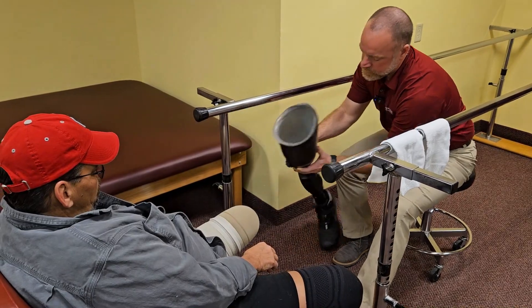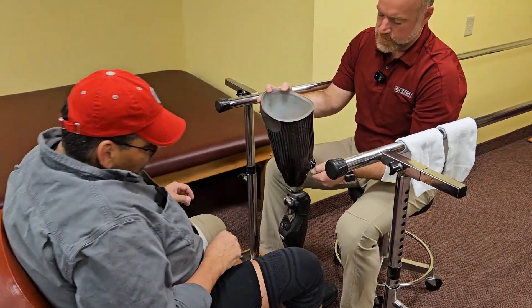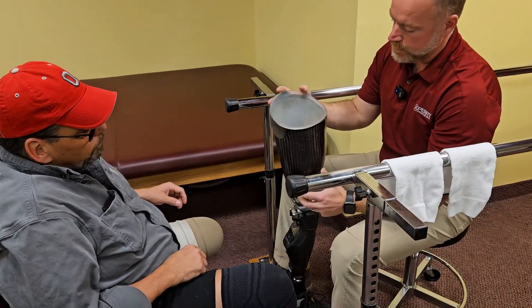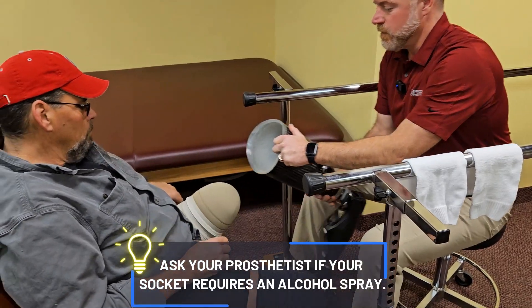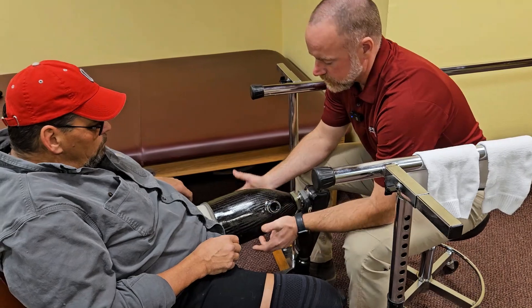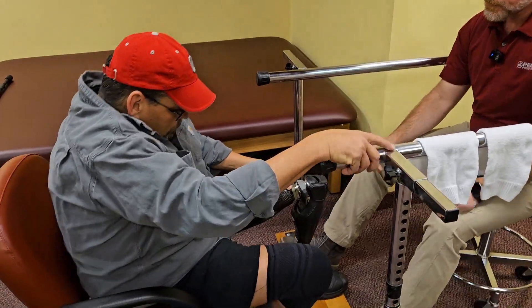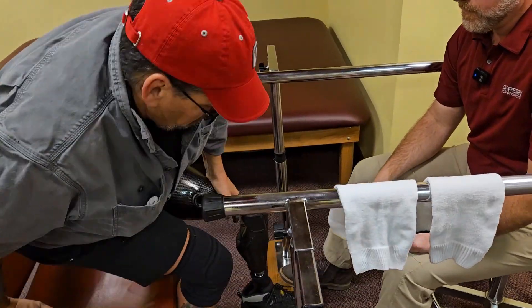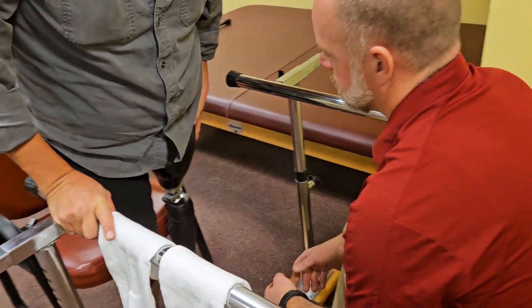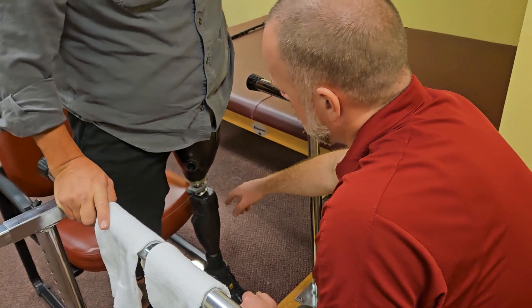When it comes to putting the prosthesis on at home, you want to find a place to set the valve. A lot of times you want to start on the prosthesis and see the position — it's only going to let you go so far — and then you can go ahead and stand up.